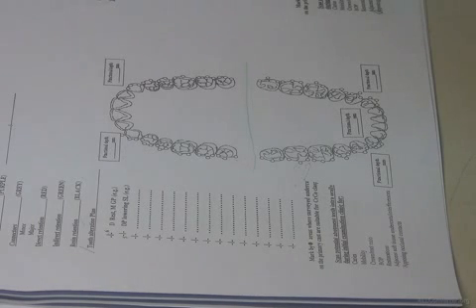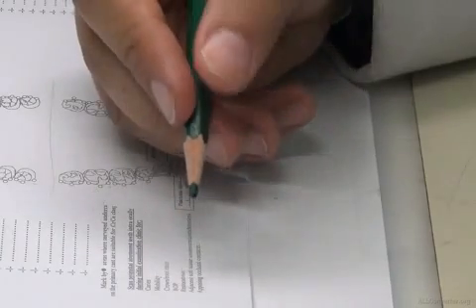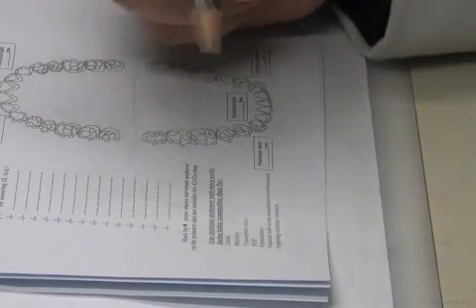So sometimes one tooth will have multiple preparations, or you'll have multiple teeth other than the abutments with preparations in them, especially if they have interferences. Now, if you go down here, this is the part you did not fill in, and we did not do in our initial design. You remember the first lab when we did the initial design. This is a bit more advanced.